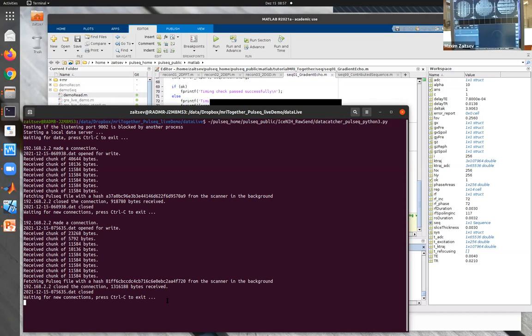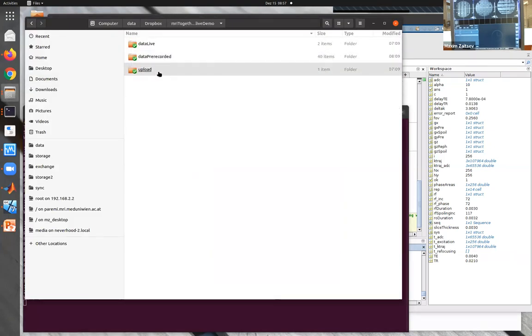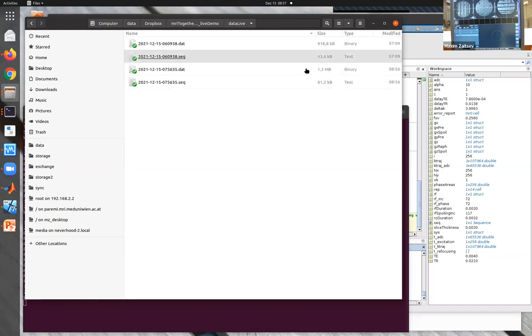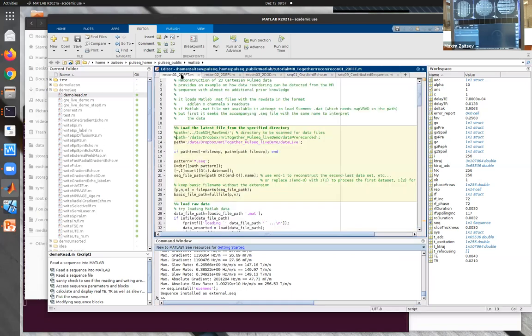So here's the output of my data catcher. There was a script which is waiting for the incoming data, and it says the raw data is coming, it recognizes the signature on the file, and it received the data and also picked up the sequence file in the background. So if we go back, we can see what's happening in the live data. You see we have a data set which was just measured a few seconds ago and that contains a dat file and a sequence file. And now we can take the Fourier transform script to run over it.